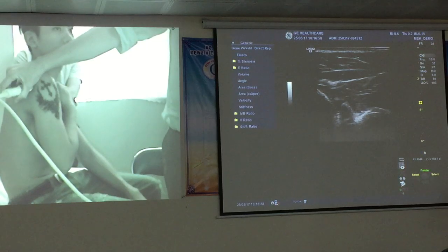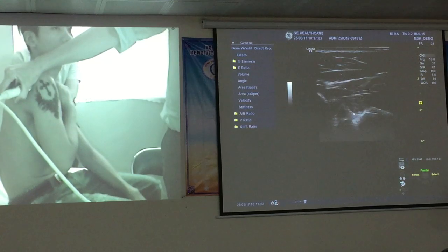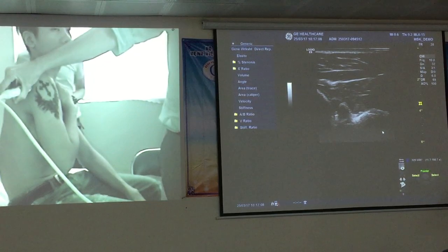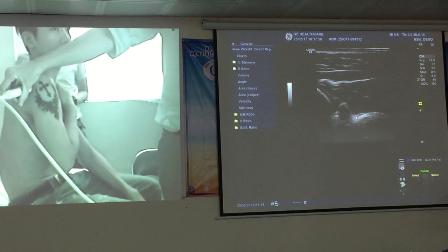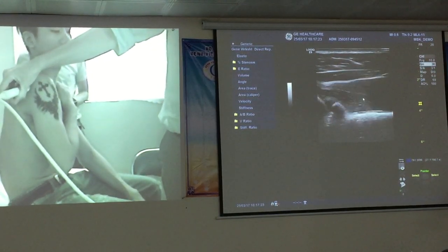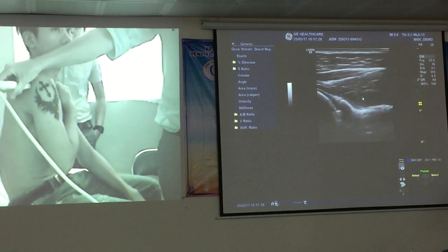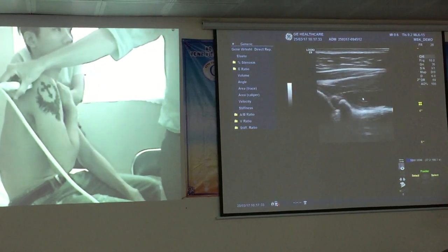In this area, in the setting of labral tears, we can get ganglia that push into this area. We look for pathology such as posterior labral tears or cystic masses compressing the suprascapular neurovascular bundle. It causes neural compression on that nerve. These ganglion cysts compress the suprascapular nerve, causing muscle atrophy. That nerve supplies the infraspinatus muscle, and sometimes the supraspinatus muscle as well.